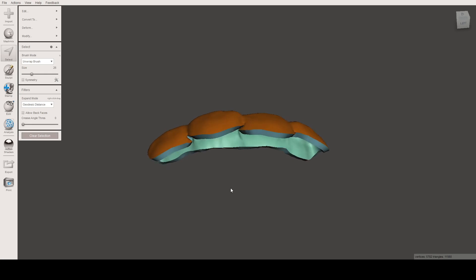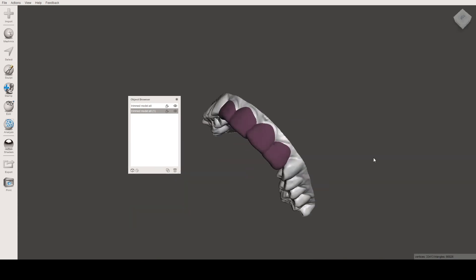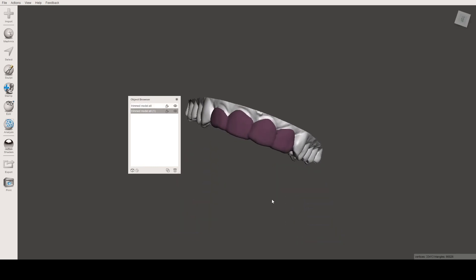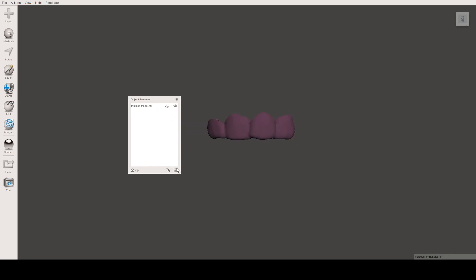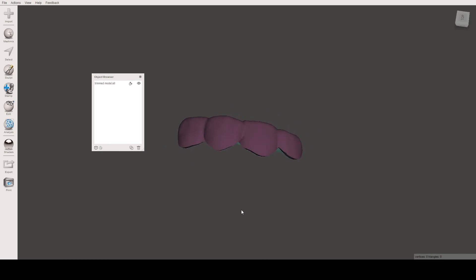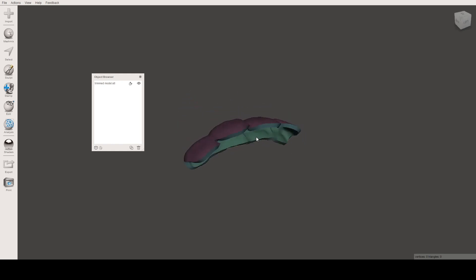Now we have our shell. We can check it on the model — let's import the model again. As you can see, the shell is created on the model and it's very smooth. You can 3D print this shell for whatever application you want. I'll later show you this shell on the model after 3D printing.